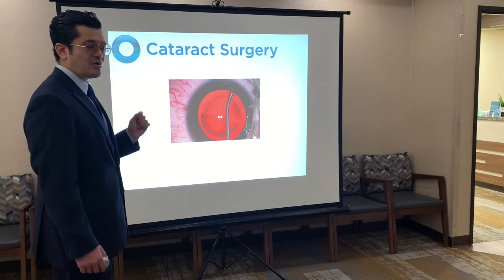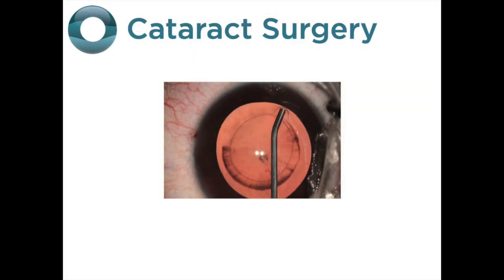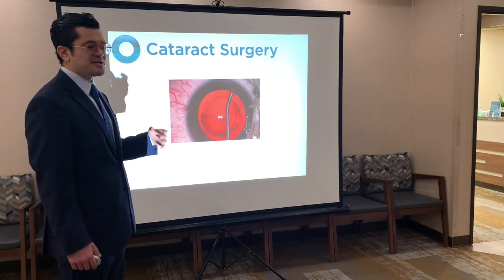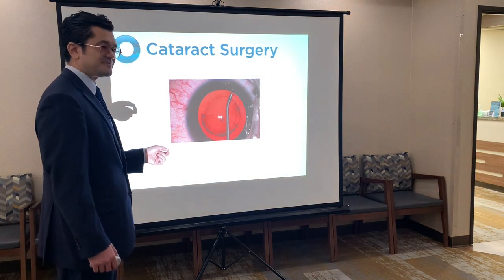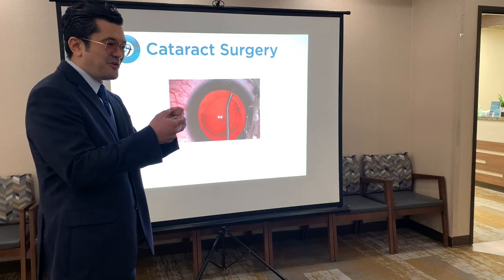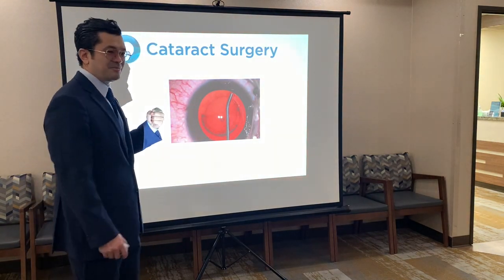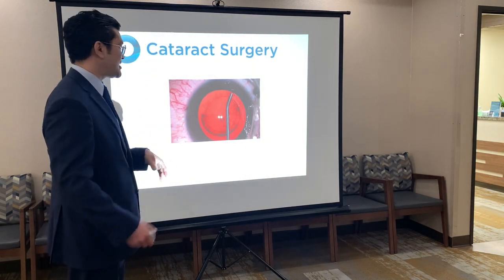and we are going to place saline solution in between the capsule and the cataract. And what this does is it creates a fluid wave or a separation between the contents of the bag and the cataract. I think it's a good analogy: when you go to the grocery store and you try to open up that vegetable bag and it's stuck, so you pinch a little bit and then you blow into it and it opens up. Well, we can't really blow air through this, so we are infusing it with some saline to open up that bag a little bit, create some space.